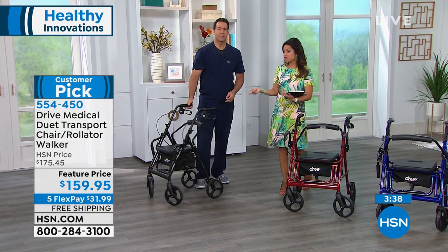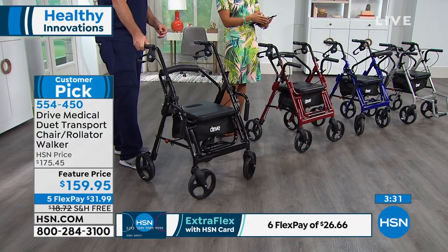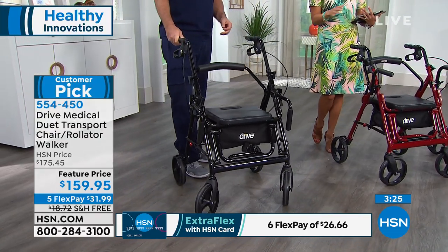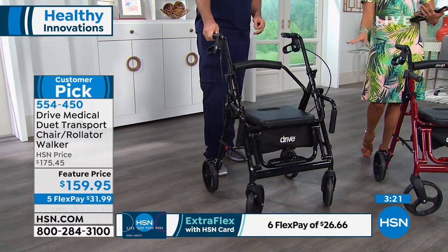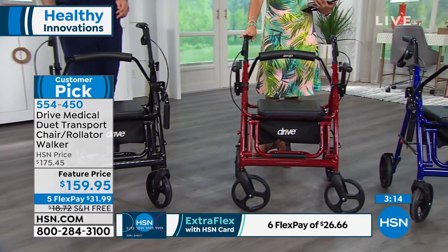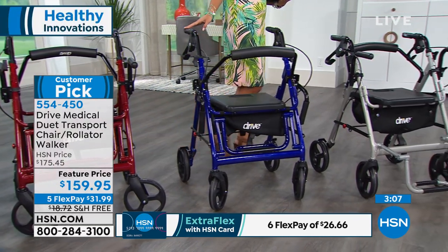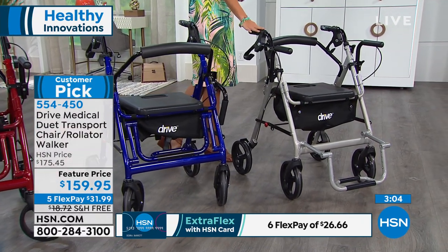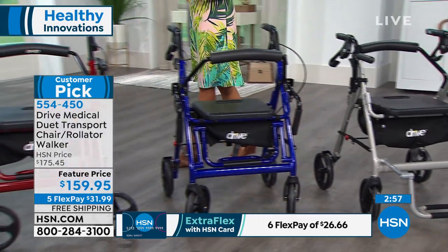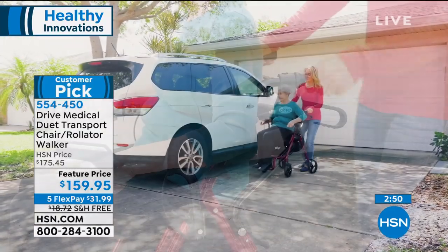It truly is such a smart idea to pick this up — 20 pounds, easy. Drive Medical designs this with physical therapists and medical professionals, putting thought into it for mobility shoppers. They understand that we're human beings who go through phases in life. What you don't want is to be forced to use a transport chair 100% of the time. Sometimes you think, I can do it — I can get up and walk a short distance. The Duet allows you to convert back to the rolling walker and walk when you feel confident, then take a rest when you need a little assistance. The safety aspects — the locking brake — these are the things that put this at the premium level.